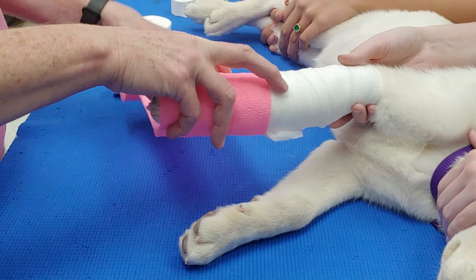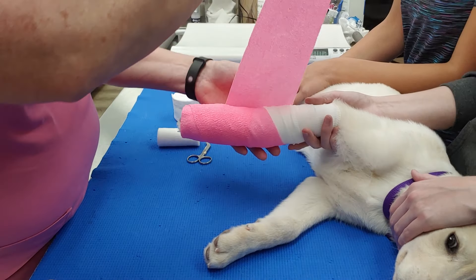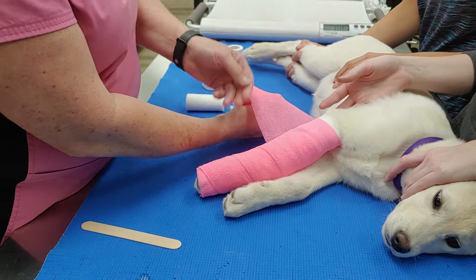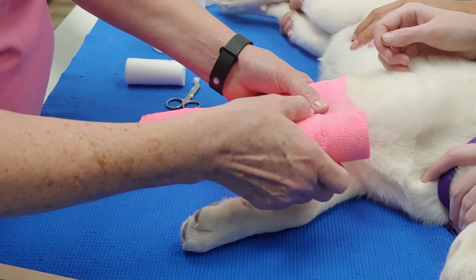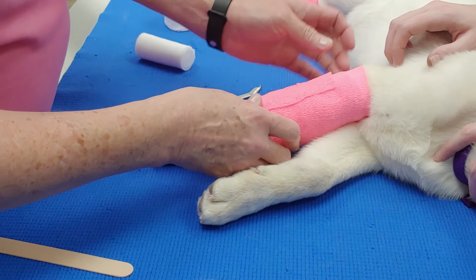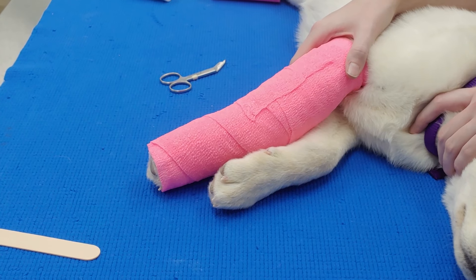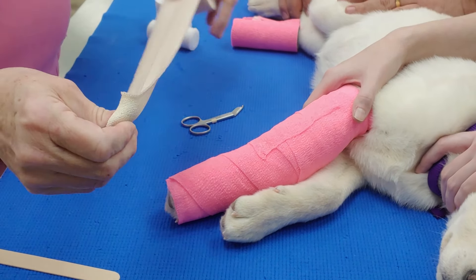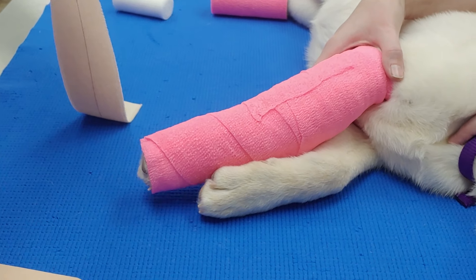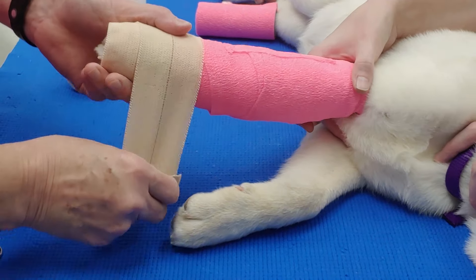Then just nice and gently lay the vet wrap on. I kind of like to unroll it a little bit first and then lay it on so that way you don't get it too tight. Then I like to get some sticky roll and put a little bit at the bottom of the bandage — it just adds a little bit of grip and support for the foot and keeps the bandage from falling apart.